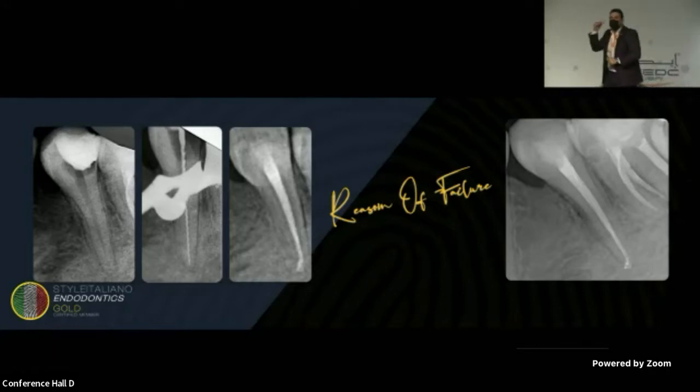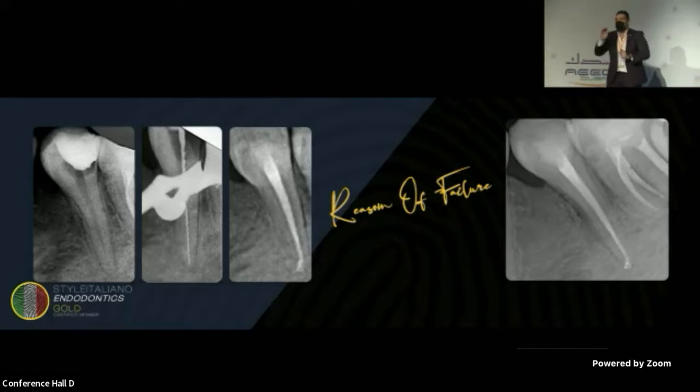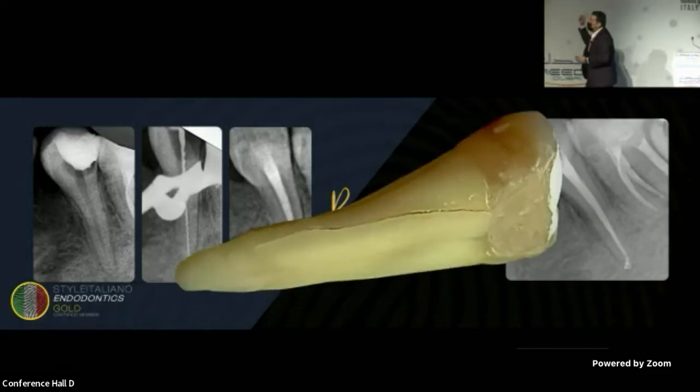And if you can see, the tooth is already in malocclusion. So vertical fractures or coronal cracks into the root were highly expected. I told them this tooth most likely has a vertical root fracture, and he agreed to extract. And this is the tooth after extraction. We can see here we have a coronal crack extended to the root.